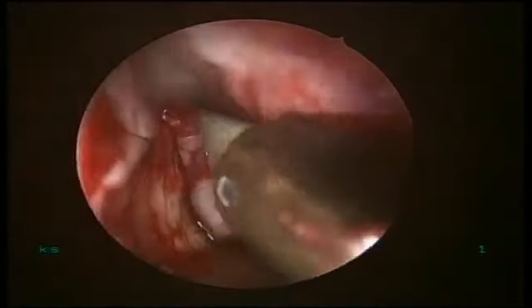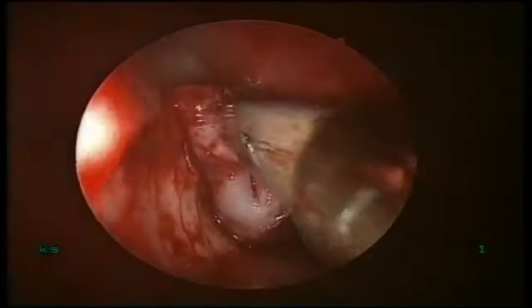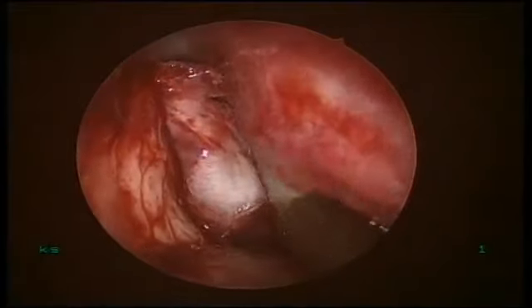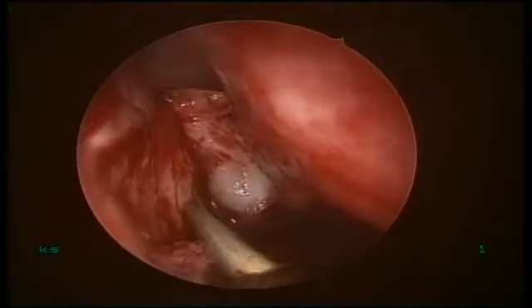Now, why did we raise this flap? Because I am not just going to open a nasolacrimal duct and leave it. It may re-stenose. So I am going to marsupialize it completely, and I want the flap mucosa to fall laterally onto this raw area.